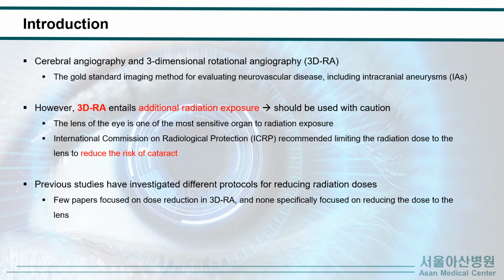Many previous studies have investigated different protocols for reducing radiation doses. However, few papers focused on dose reduction in 3D-RA, and none specifically focused on reducing the lens radiation dose.